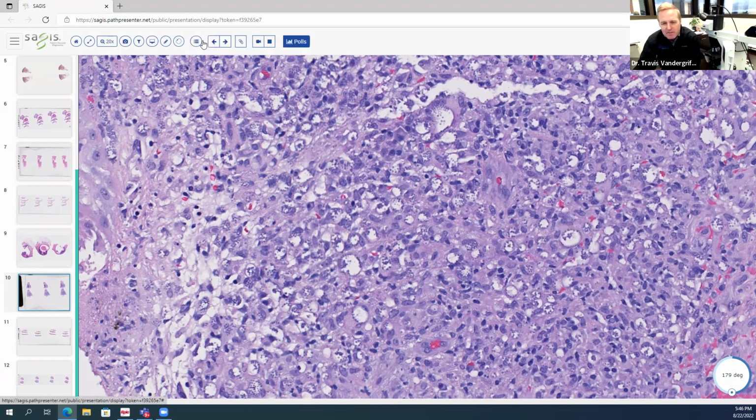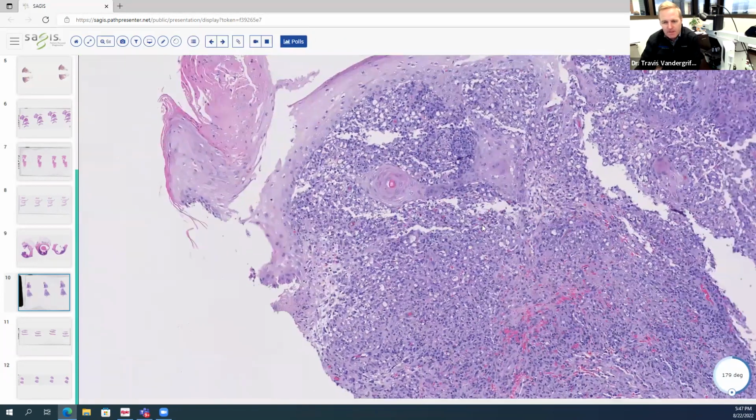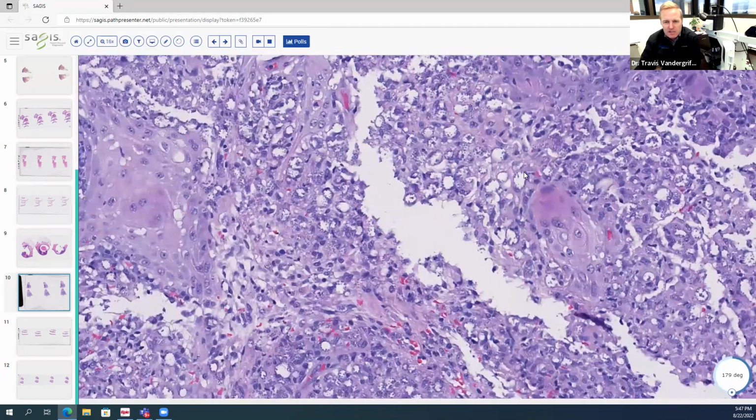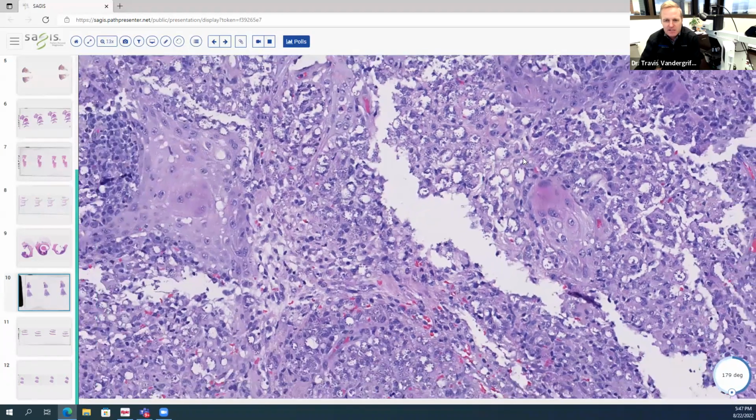But suffice to say that in Leishmaniasis, the organism is round, but at one pole you get this hyperchromatic dot, and that's called a kinetoplast. And you can see them with a 40x objective, and you would not expect to see that in histo. So because of the configuration at the periphery of the histiocytes, and then also looking for kinetoplasts, you would diagnose this as Leishmaniasis.